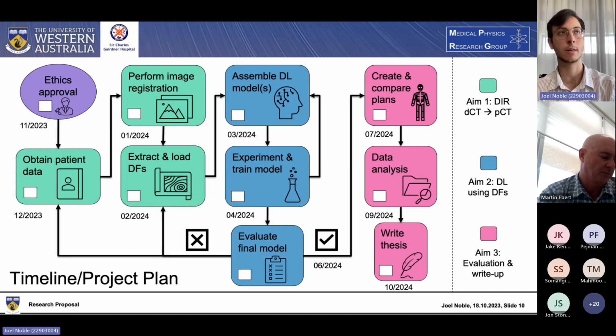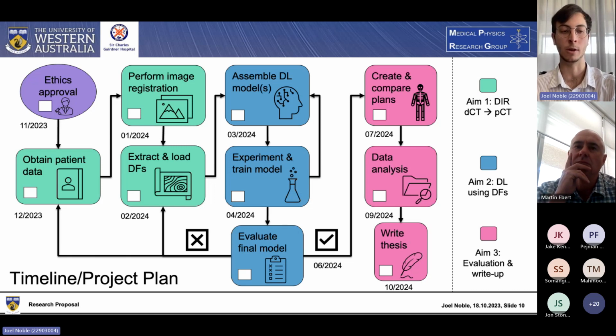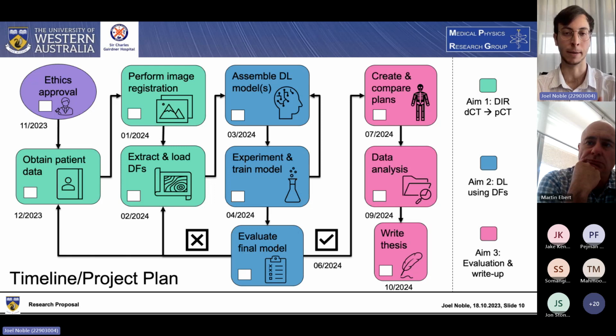Yeah, I certainly think the studies didn't explicitly allude to that or mention a specific dose tolerance. But from what I was looking at, it does seem, particularly for adaptive radiotherapy, quite excessive to adapt the plans on the day, because even the direct plans, when they were directly using diagnostic CTs, were within the generally clinically accepted 5% tolerance. But yes, even then, I think there is additional scope, which partially explains why SFRT is mostly being done in a palliative context. So that's something that's helpful to keep in mind. Thanks.